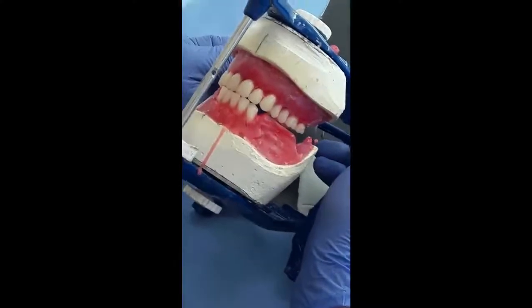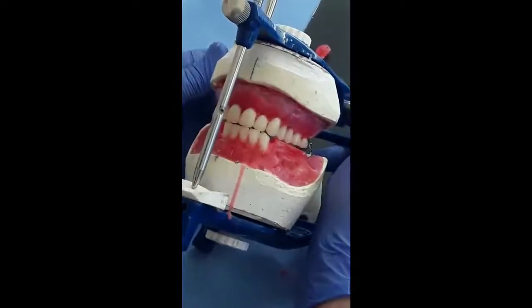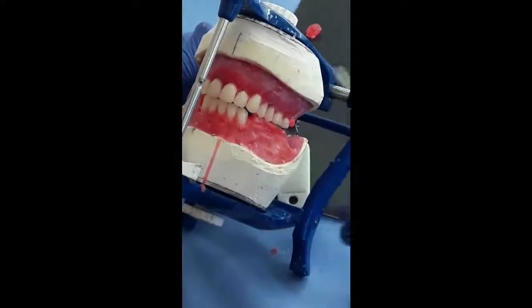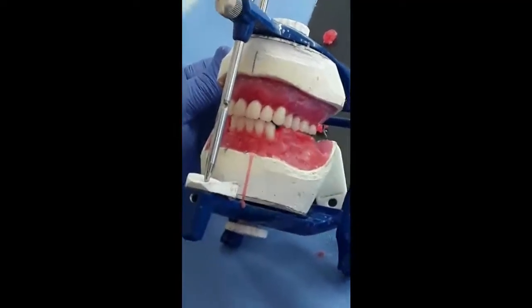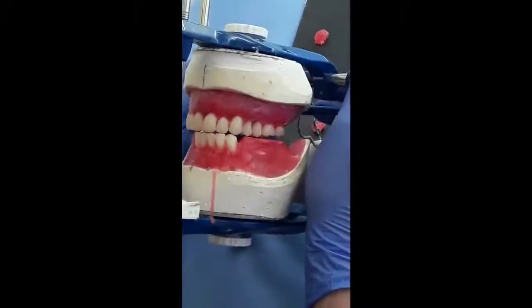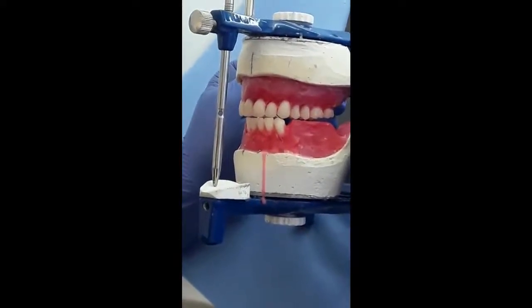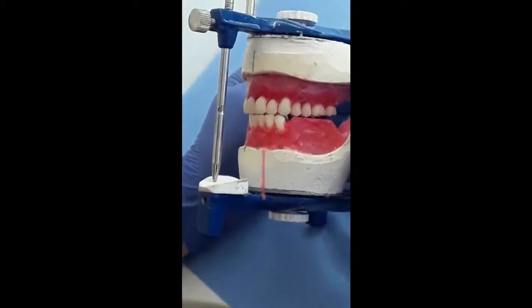Now you see, now I can achieve edge to edge contact without separation. Now with the canines I need to achieve tip-to-tip contact between the maxillary canine and the mandibular canine in lateral excursion without separation. And you can notice here that I can do this lateral excursion and the tips of the canines, the maxillary and mandibular, are very close, almost touching without separation.